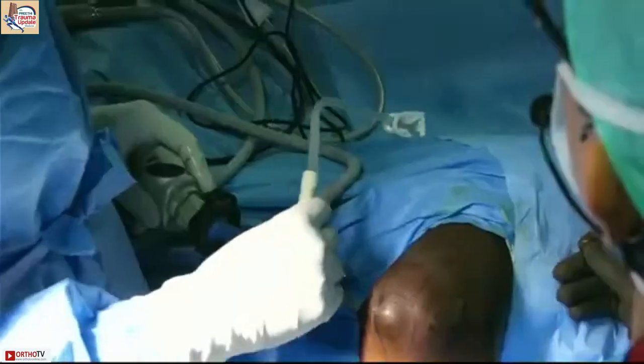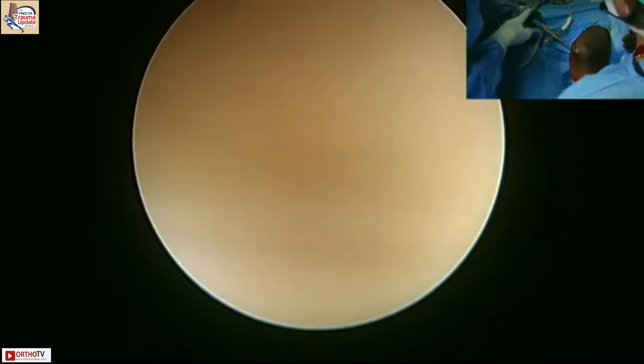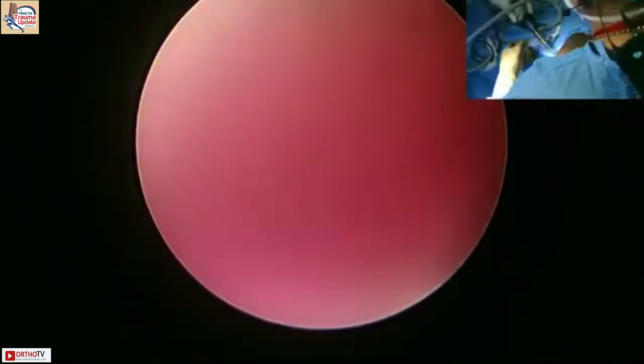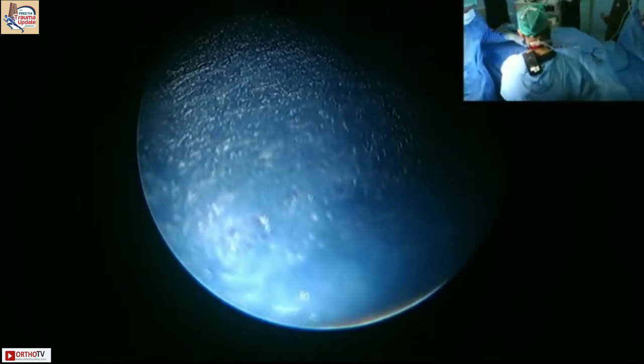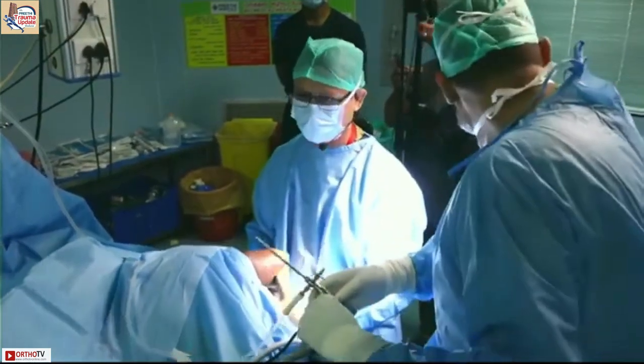Somebody wants to start scopy, what are the cases you recommend that we start off with? You have to spend time observing it. I think elbow is the wrong joint to start scopy without understanding it, because it's a very difficult scope. You can sometimes see us struggle, and as always in surgery, you struggle. Let me try. If you want to do a first scope, do it with the lateral epicondylitis or a similar case. Give me the 2.7 scope, please. It's elbow scopy. You have to see a few, you have to help a few, then you can think of doing.